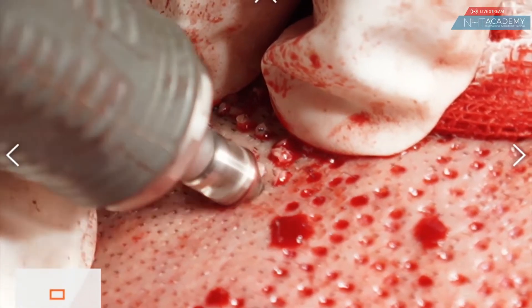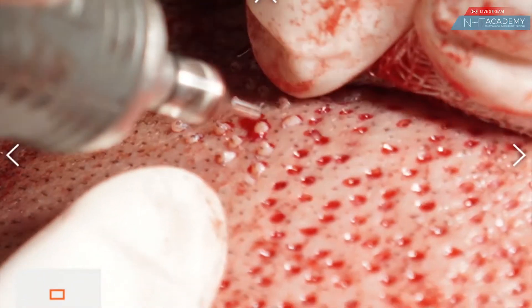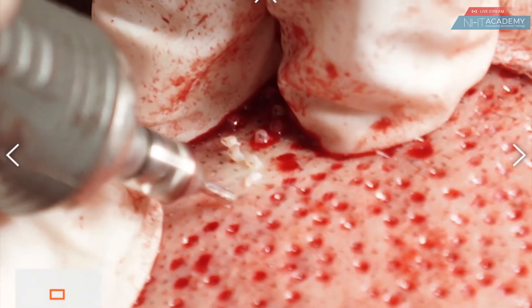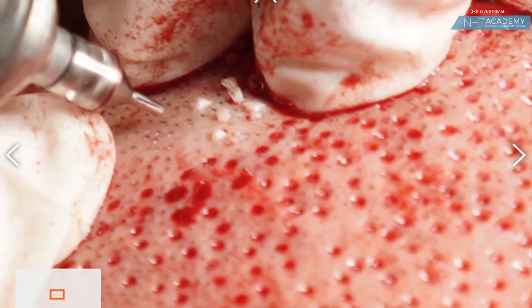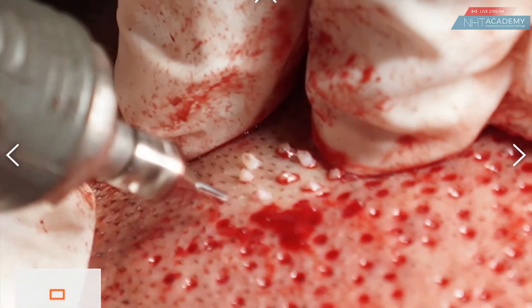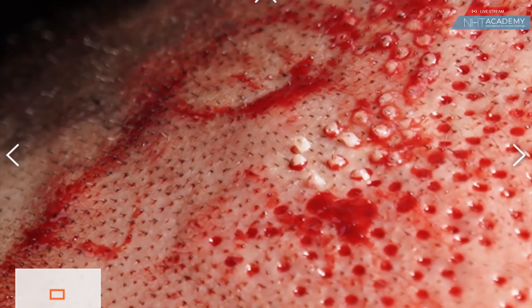This skin type we have right now, the tissue is quite soft. As we've said before, when it's soft you have to go a bit more slower, a bit more careful so as to not break any of the grafts or burn any of the grafts. Right now at the back of the head, the complete back of the head, you can go a bit more faster, but that is going to change according to the skin structure that you have.